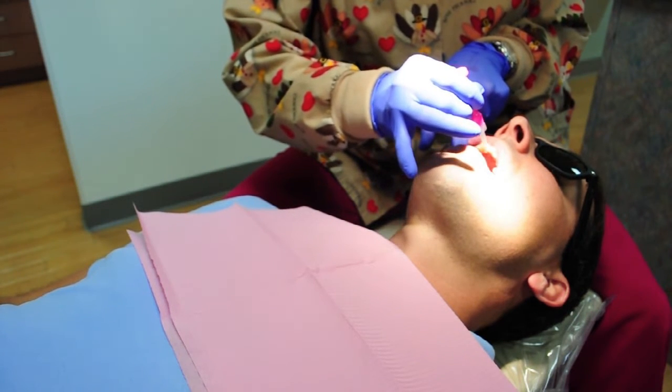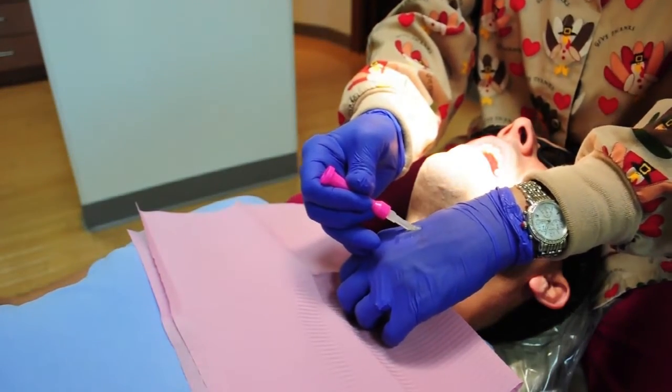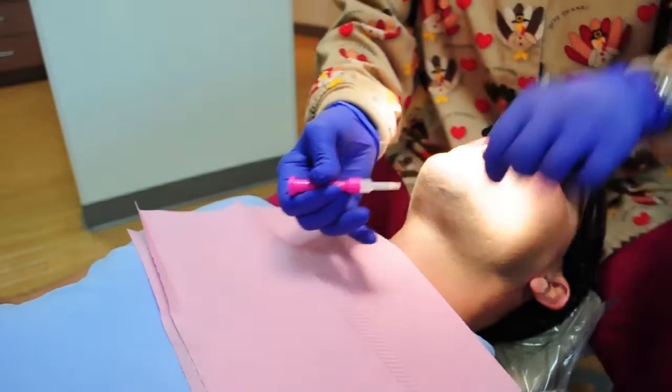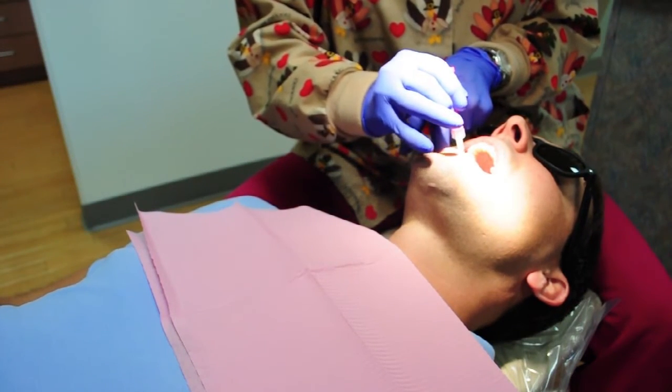For primary dentition, we find that it's easiest to have them bite together, give us a big smile, and apply FluoriMax to the upper arch and lower arch in 1 single swipe on each side. After application, wait 3 seconds for the layer to dry, and you're done.